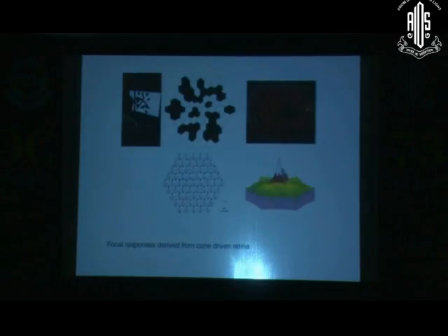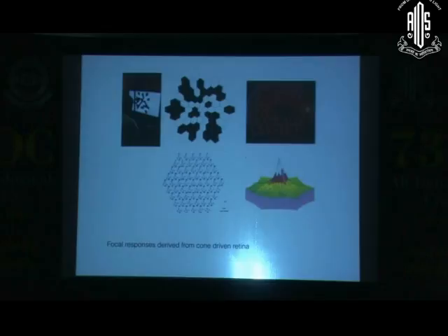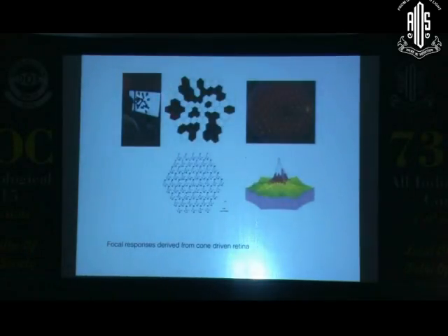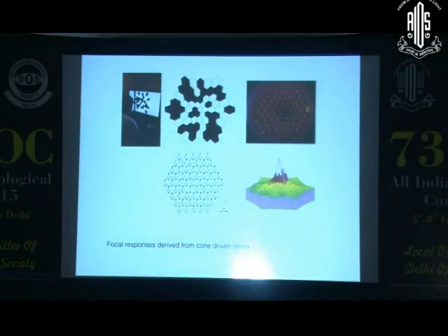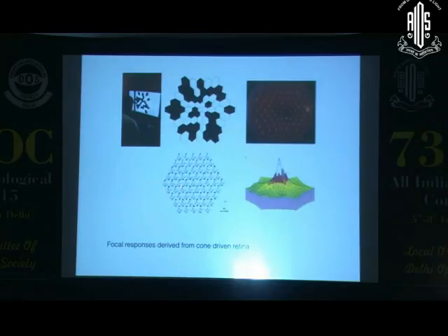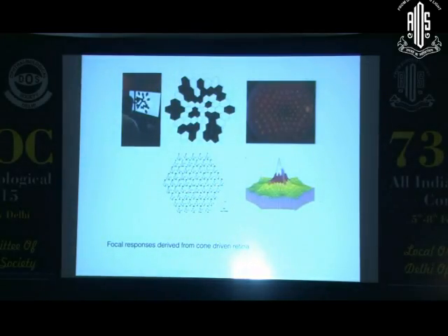What is essentially done is you have this kind of stimulus pattern with small, separate stimuli, which gets responses from small focal areas of the retina. That comes out as a trace here in different patterns. We'll see how the printout comes. And these small waveforms are what constitute a multifocal ERG.